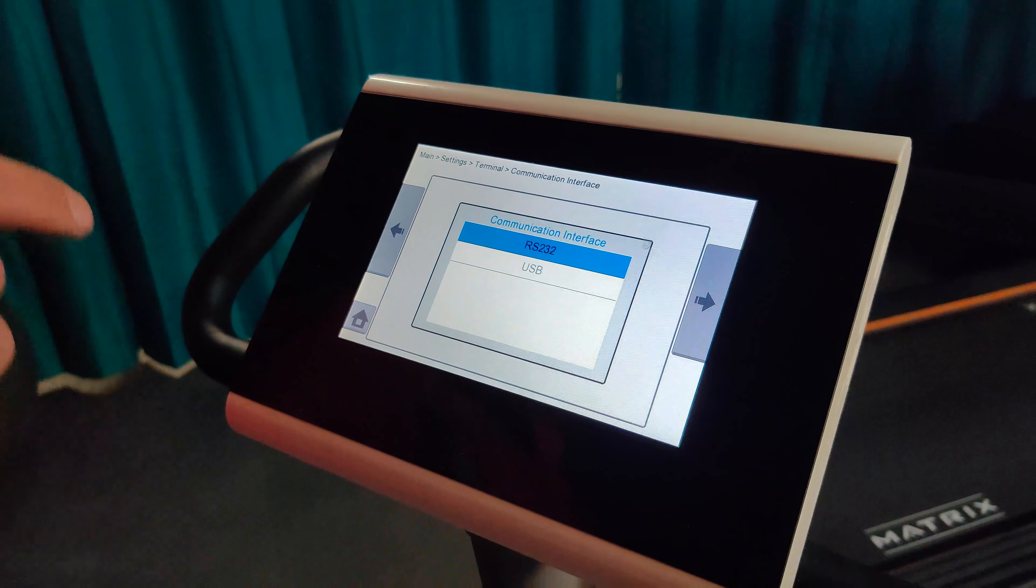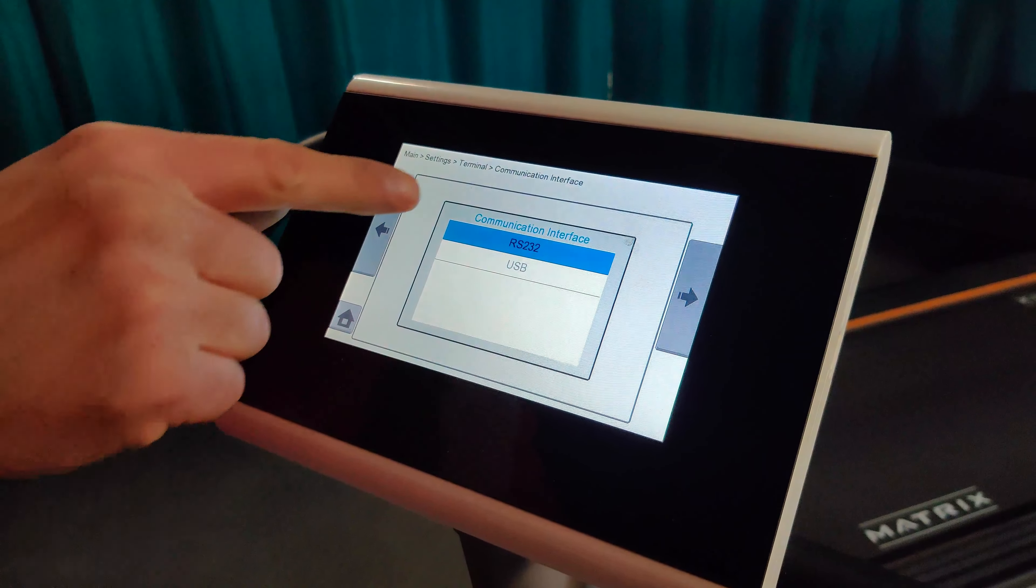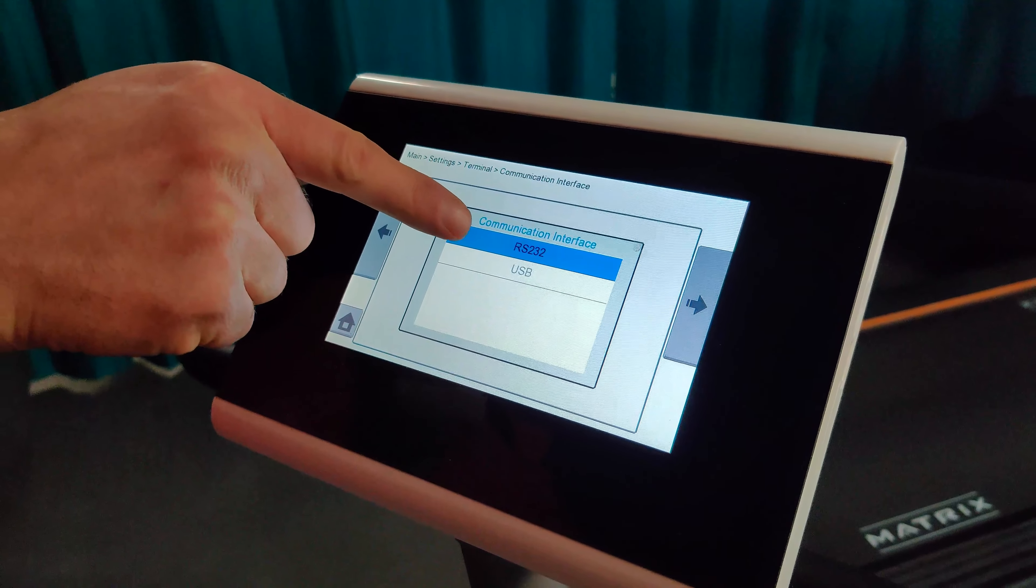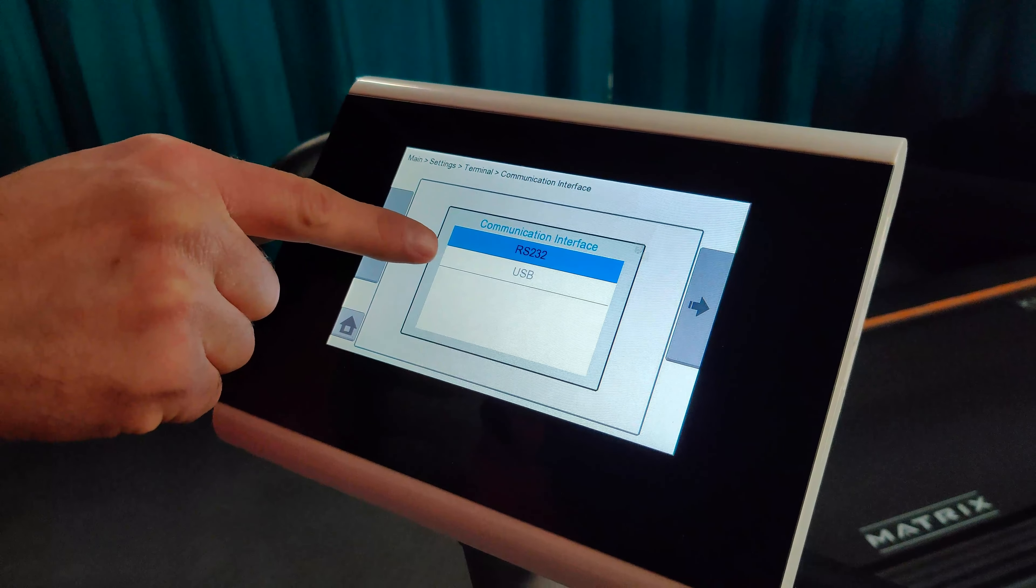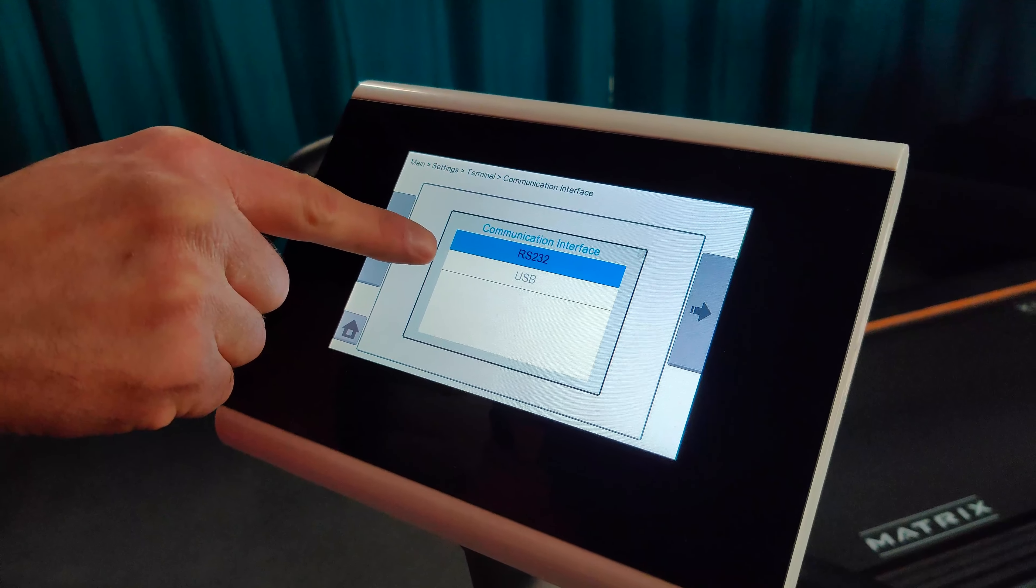Make sure the communication interface matches USB or serial cable, whichever you have chosen to connect to your computer or laptop.